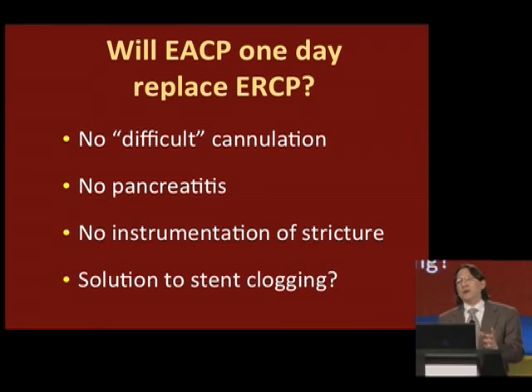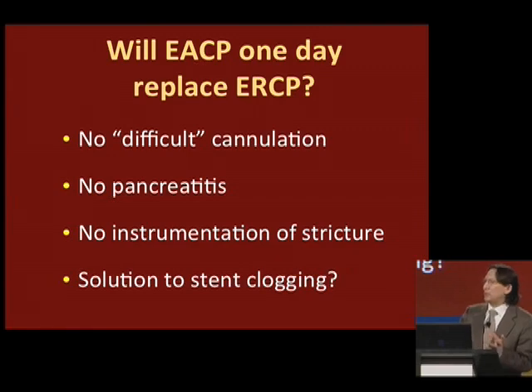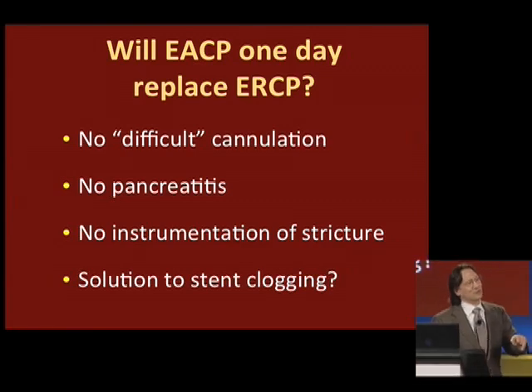The question that arises as this disseminates is whether EACP will one day replace ERCP. Will the anterograde approach replace the retrograde? Well, we eliminate difficult cannulation. There is no risk of pancreatitis. That's an important one. That's, of course, our nemesis has always been the risk of pancreatitis. We're working above the pancreas. We don't touch the pancreas.